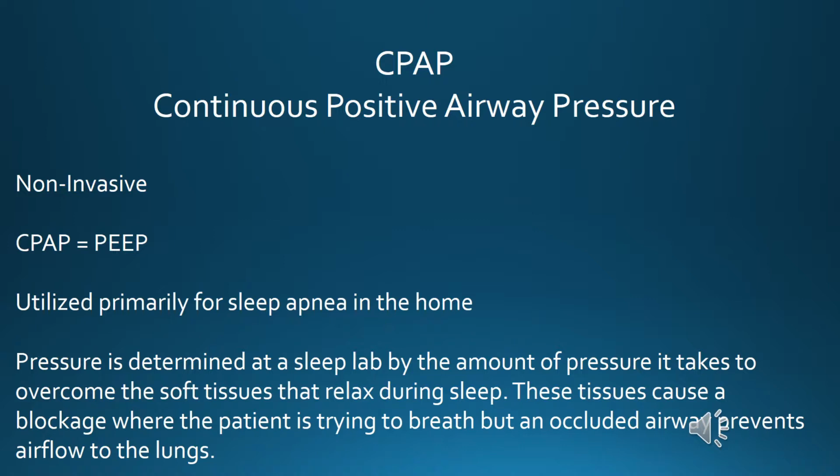CPAP. CPAP has a couple of meanings. On the invasive side, it goes with that pressure support ventilation on the last slide. So PSV, CPAP, you dial in pressure support of 10 and say CPAP of 5. Now the CPAP we're getting ready to talk about is the non-invasive form. Simply put, continuous positive airway pressure equals PEEP, which is positive end expiratory pressure.